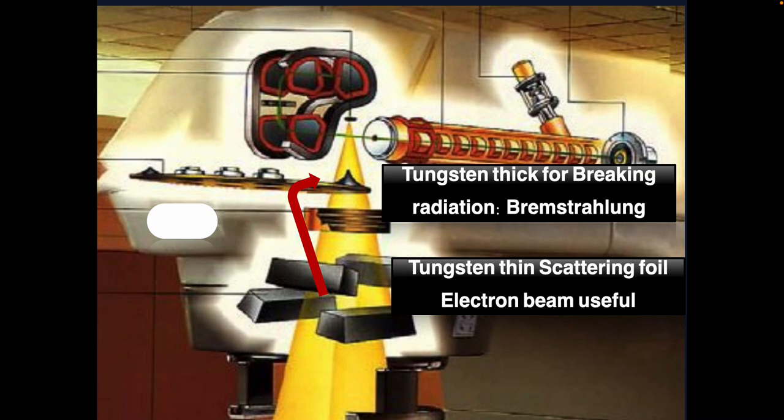So what is the importance of this? Why am I telling you this whole story? I want to tell you this whole story because in different machines, from different vendors, the design of the head of the machine and the way we generate the electrons is different from one machine to another. And this makes the parameters or the beam characteristics for the electron beam differ from one machine to another. You cannot use the parameters in your department and, whenever you move to another department, use the same parameters. You cannot do that, unfortunately.